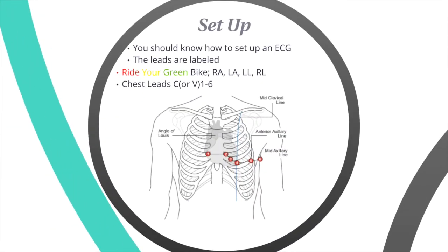Set up. This is really, really important. I say this because I had a station just like this in the exams. There was a dummy, one of those CPR dummies, on the bed, and there was an ECG machine next to it, and an invigilator.